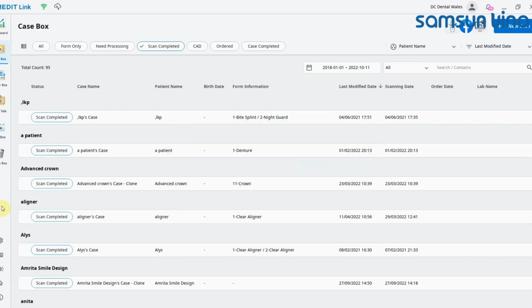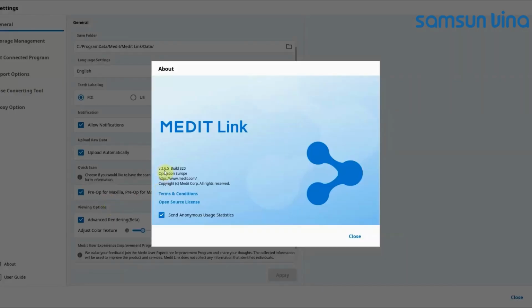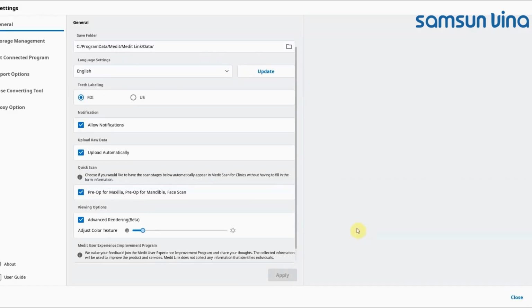Okay, so to check which version you're on, you go to the settings cog down here and click About, and it will flash up the version that you're on. So this is 2.6.5 build 320, so that's the latest version. If I wanted to check for a new version, or if I knew there was a new version and I wanted to install it, all I would have to do is close down Medit Link and restart the software, and then when you restart it will automatically flash up if an update's available for you. Just click install and run through the procedure as usual.